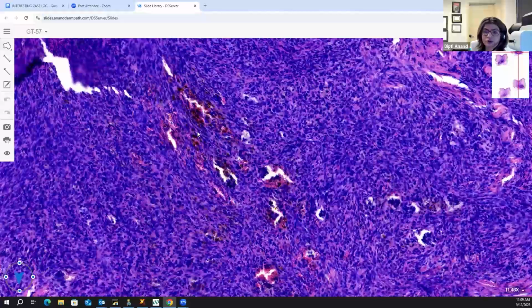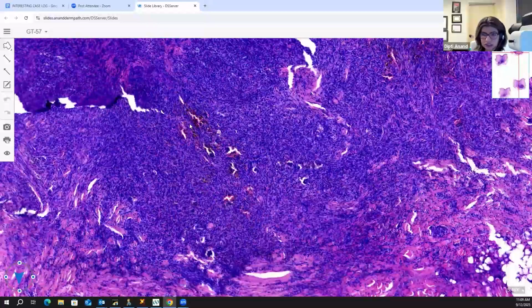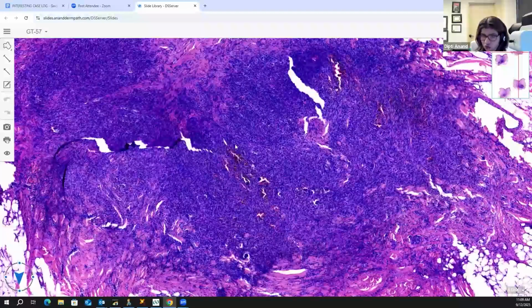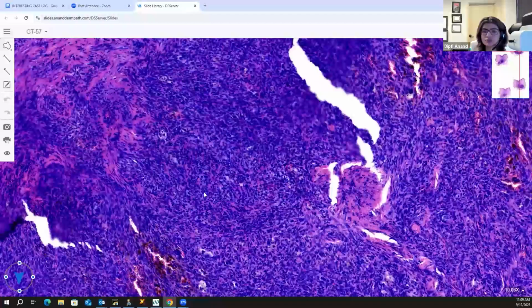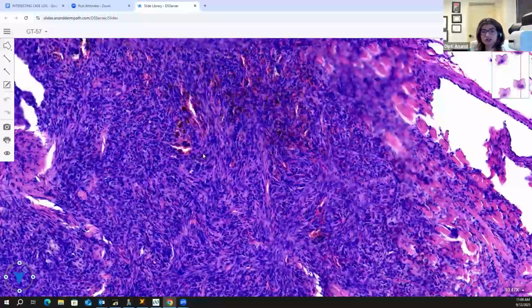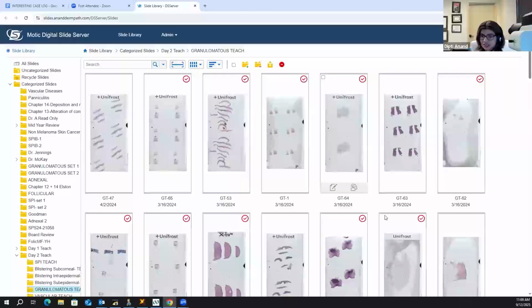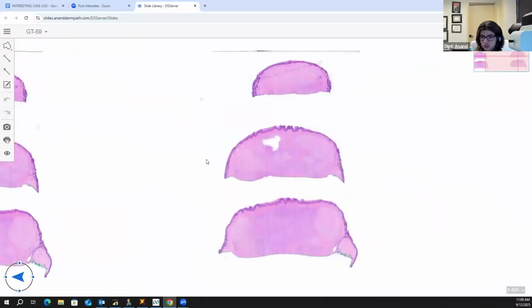The presence of hemorrhage and inflammation within the lesion actually favors it to be benign, because the malignant tumors like DFSPs, they don't have it. They neither have hemorrhage nor do they have inflammation. So a cellular dermatofibroma or a hemosiderotic dermatofibroma or a xanthomatized dermatofibroma, which has a preponderance of giant cells and even fat-containing lipid cells, like for example this lesion, they can also mimic granulomatous tumors.